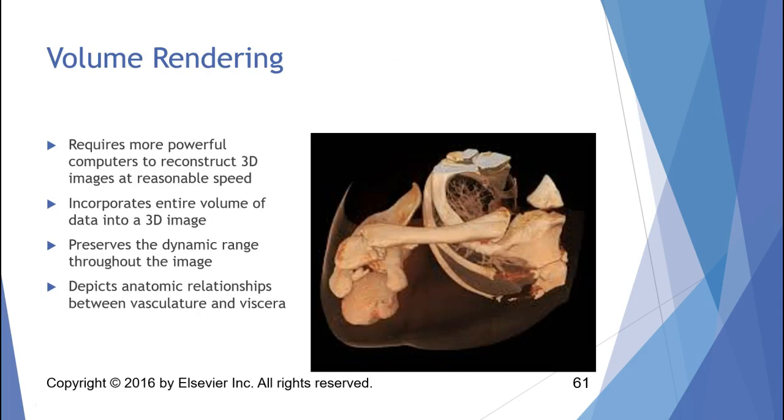Volume. Okay, this requires powerful computers to reconstruct the 3D images. Otherwise, it'll take forever or hang your system up. So you have to have a good, powerful system. It takes the entire volume of data and makes it into a 3D image.